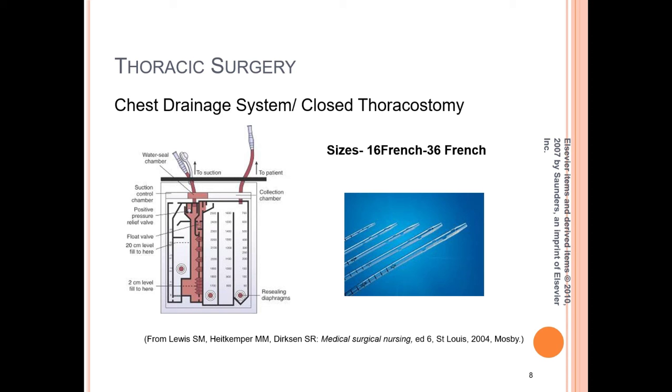The chest tube system will be aseptically placed on the back table before it is used. Chest tubes are sutured to the chest wall with a heavy non-absorbable suture and dressed with petroleum gauze, fluffs, and flat gauze. A sterile petroleum gauze is kept with the patient at all times in case the chest tube is dislodged. This gauze would be immediately placed over the hole to prevent air from entering the thorax and deflating the lung. It is also important to keep the drainage system below the level of the patient's chest.